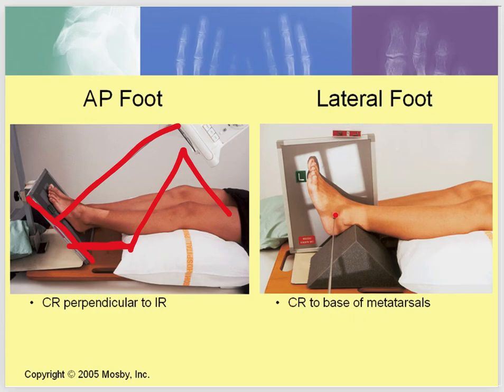And your lateral foot is a lateral to medial, and this is usually done if you're doing it, say, somebody in a wheelchair, somebody in a stretcher, because it's easier to do this instead of coming from medial to lateral. It's very fine to do lateral to medial, more comfortable for the patient in the stretcher, easier to position, and it still images that lateral foot, either it be a medial lateral or lateral medial image.